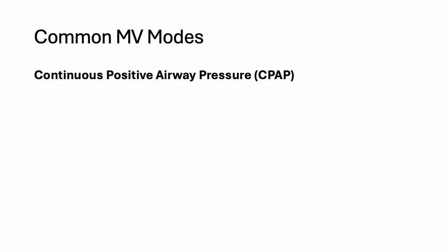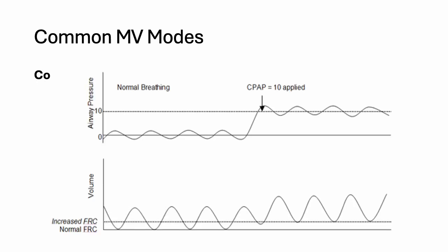Graphically, this is how CPAP is illustrated. I already illustrated CPAP in part 1 of the lecture in one of those graphics, but I'm using another graphic to demonstrate it. The top graph, again, is a pressure time graph. When we're looking at normal breathing, this is what you and I are doing. Airway pressure at reference 0, atmospheric pressure. This is what we are doing.